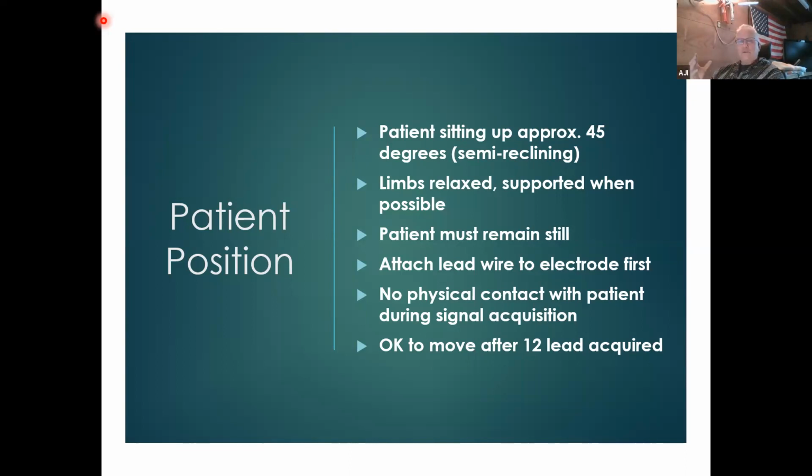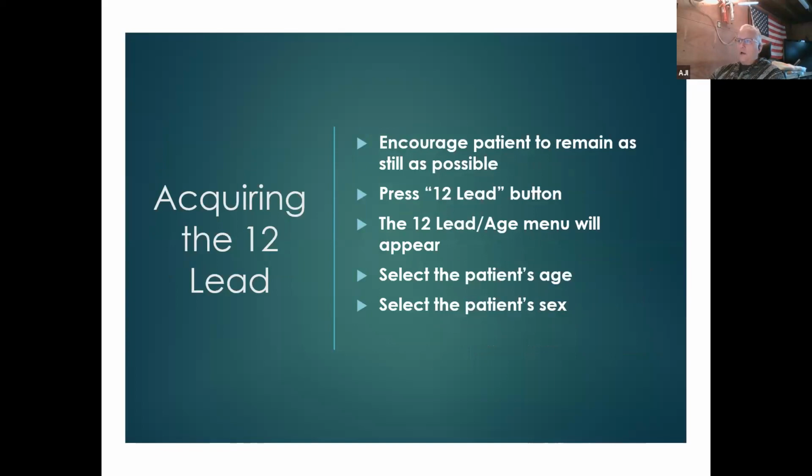And again, this is going to be specific for the agency you're working with. This is to give you a broad general overview of what EKGs are about. So, all right, then the patient is going to be quiet. We're going to hit the 12 lead button on any monitor you're going to use. There is a procedure on each monitor to do that. On each of those monitors, it's also going to ask you for the age and the gender, because with the age and the gender, it's going to actually give an electronic diagnosis.